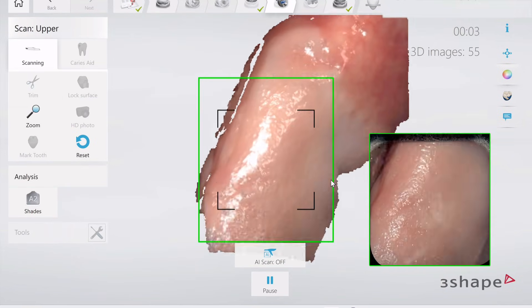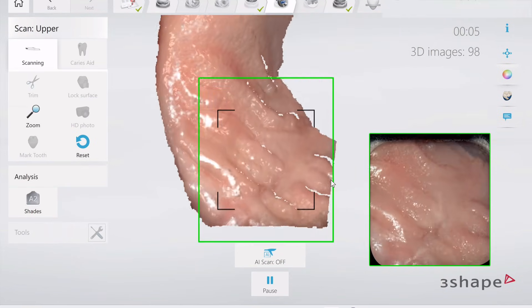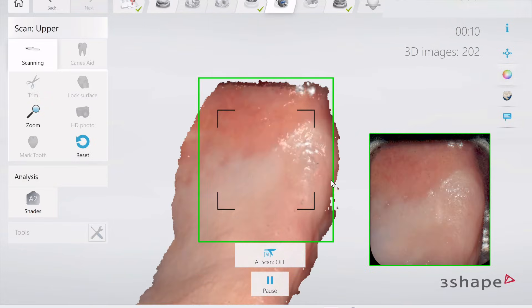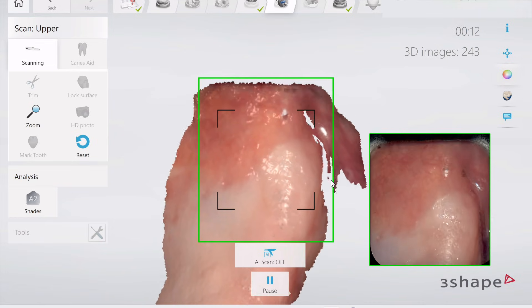Hey guys, just showing a real-time scan with the Trios 5 here with the Mod Retractors. We're doing a maxillary scan, and what I like to do for that — the retractors are in place — I like to get the attached tissues first.